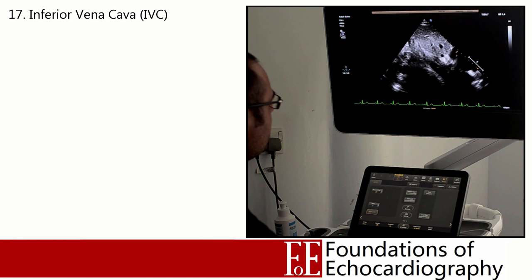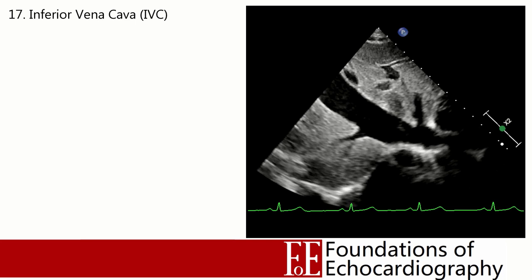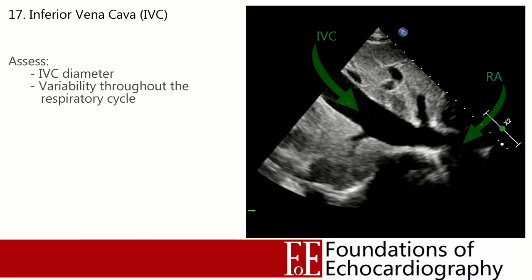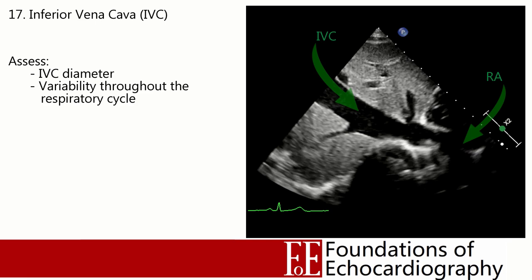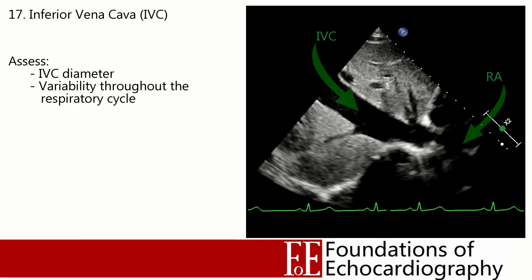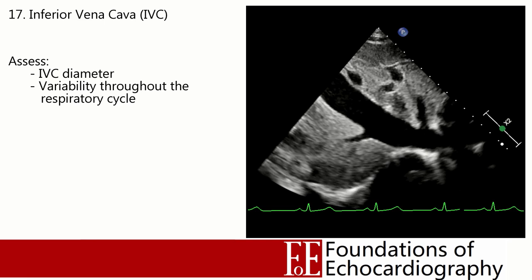Next we identify the inferior vena cava running into the right atrium. Lift the body of the probe and rotate anti-clockwise 90 degrees so that the orientation marker points straight towards the head, then tilt the imaging sector slightly towards the patient's right. Here we can see the IVC running through the liver into the right atrium, as well as the confluence of the hepatic veins inserting into the IVC. Measuring the IVC's diameter and collapsibility throughout the respiratory cycle can be useful for estimating fluid responsiveness, which will be covered in detail in a dedicated lecture later in this series.